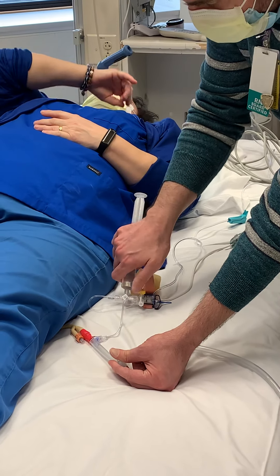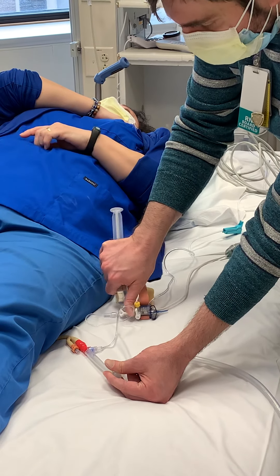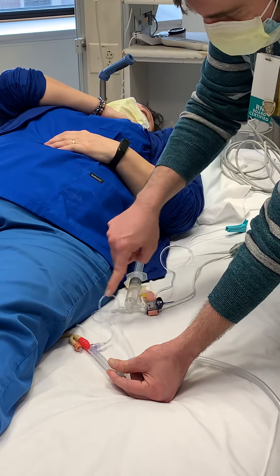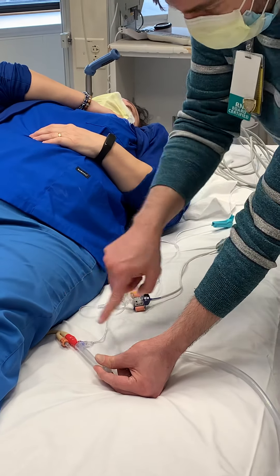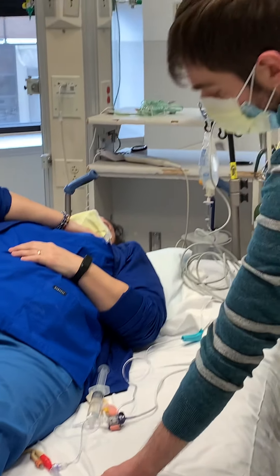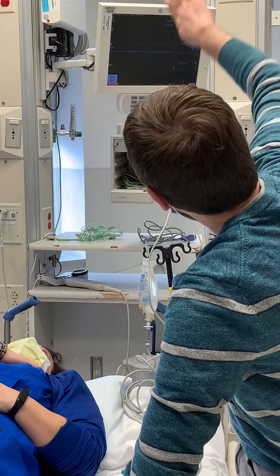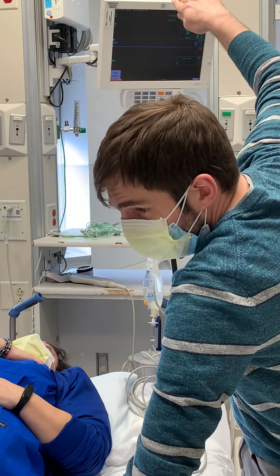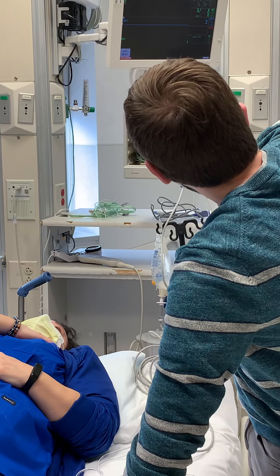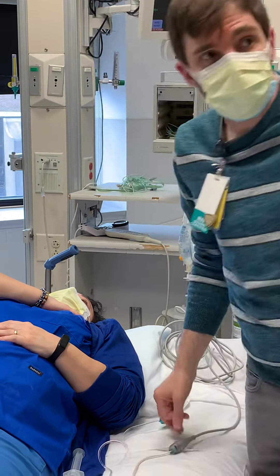Immediately turn your stopcock back open so that you can see the communication between the bladder back to the monitor. Now look at your waveform — keep the tubing pinched. The waveform is going to peak when you're flushing that fluid in, then start to plateau back down and reach an equilibrium baseline. Take the first reasonable number that you see.